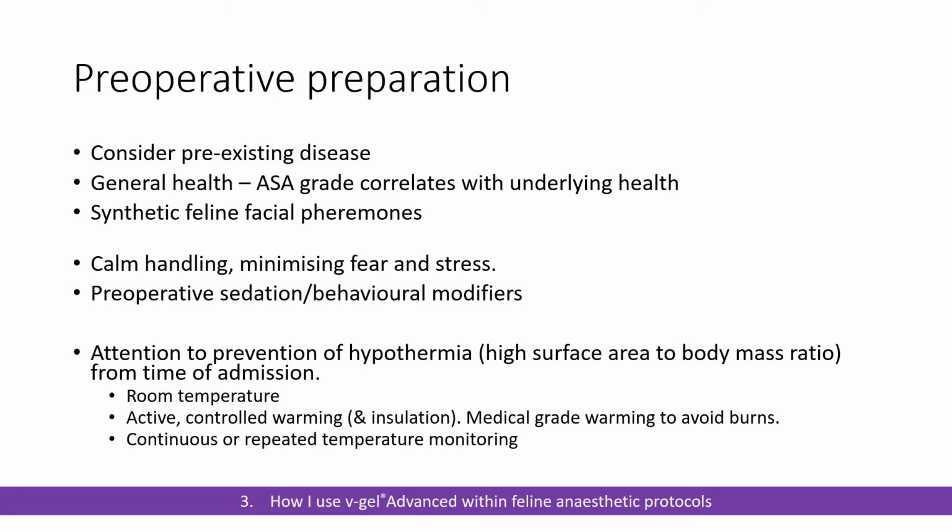You should be thinking about temperature monitoring that patient from the time it arrives at the practice, so having a temperature check as the first thing that you do, all the way through your pre-medication period, into your induction period, maintenance and recovery. You should never be letting your patient get cold and then try to warm them up. You want to identify temperature issues at a very, very early stage and manage that.